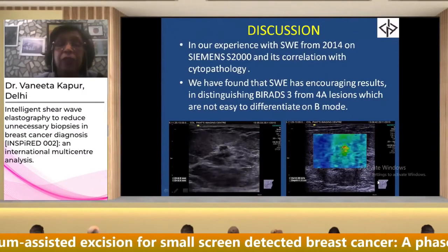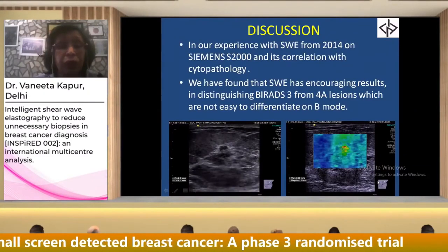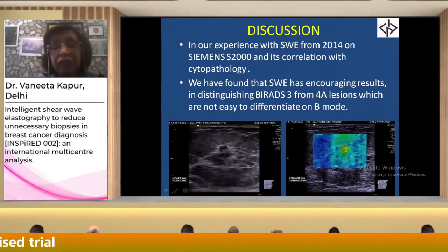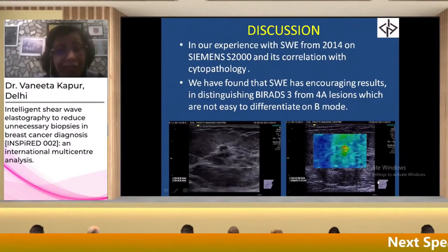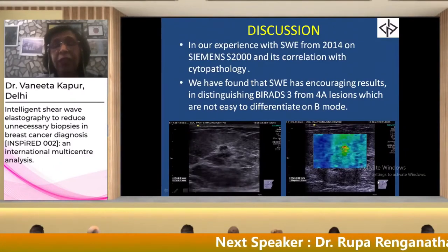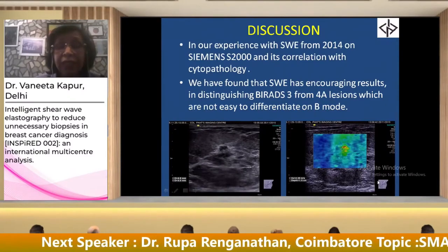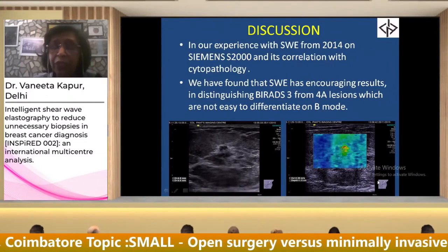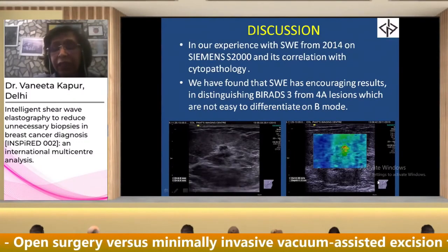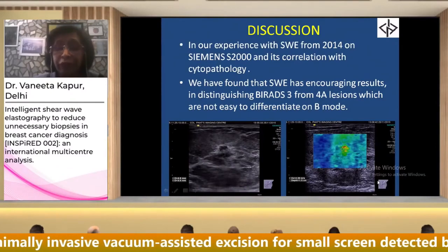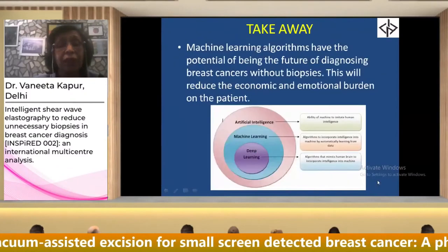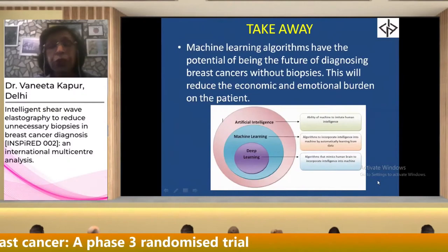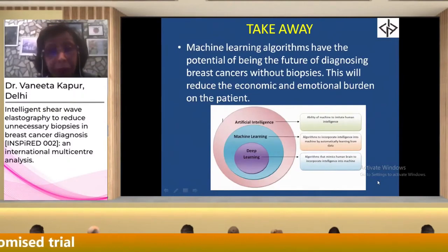In our experience with shear wave elastography at our center from 2014 on the Siemens S2000, we found that shear wave elastography has very encouraging results in distinguishing between BIRADS-3 and 4A lesions, which are not easy to differentiate on B-mode. The area shown in green shows a value of 4.38, while the hardest area can be far above 4.5, which is considered the cutoff value.